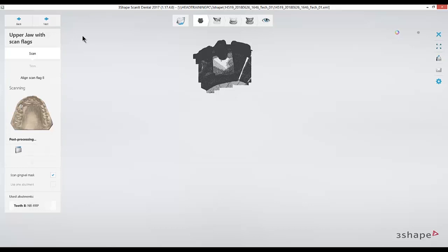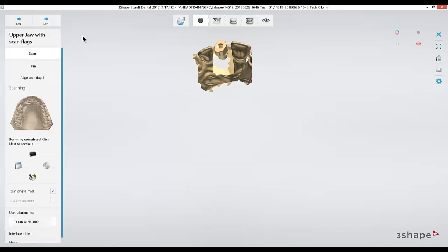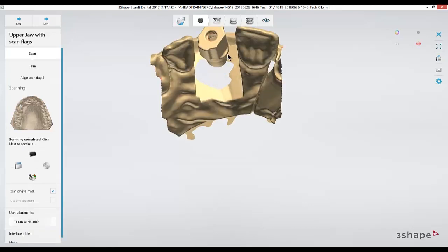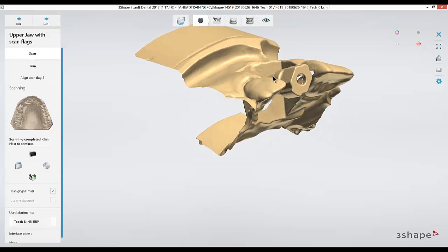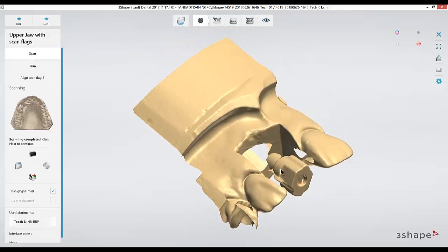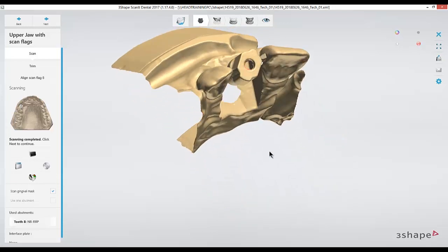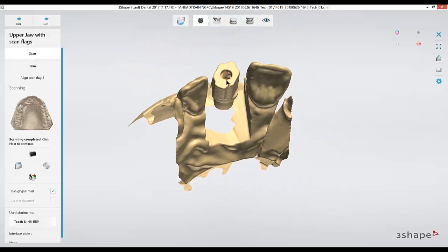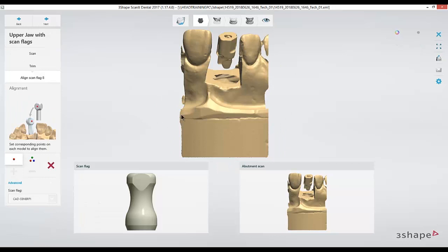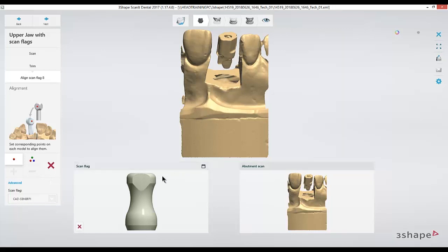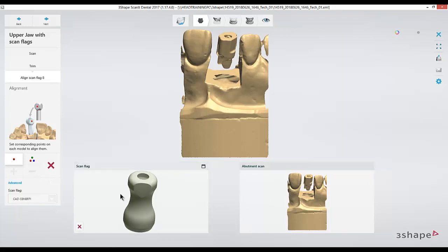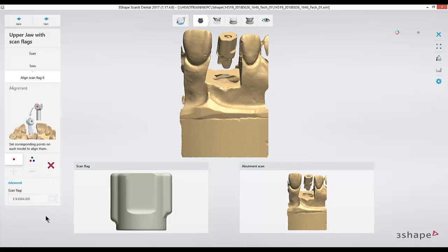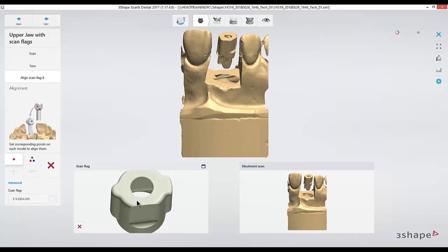After the detail scan is completed, I can continue next and it'll force me to line up the scan that I just took to the digital version of the scan flag. With this library, which you may not see with all libraries, it does have multiple options for scan flags. In this case, since I can see that the scan flag it's chosen does not match the scan flag I scanned in, I'll go to the option in the bottom left to switch to a different scan flag.